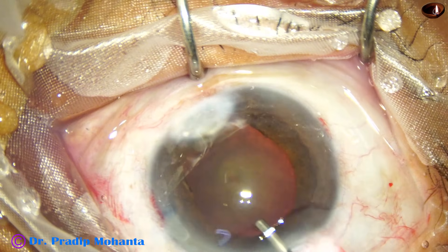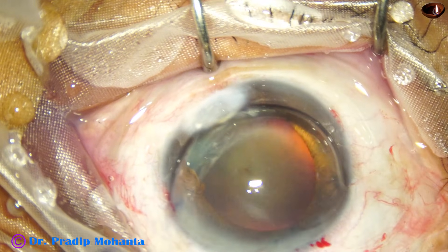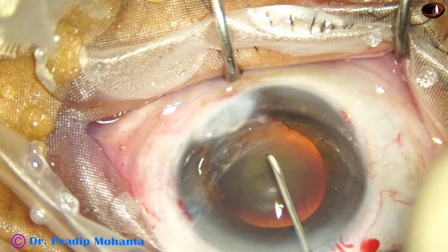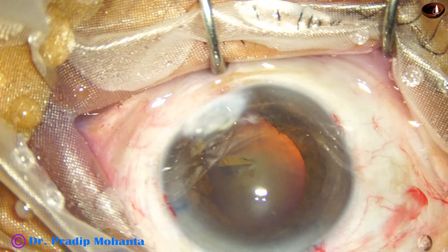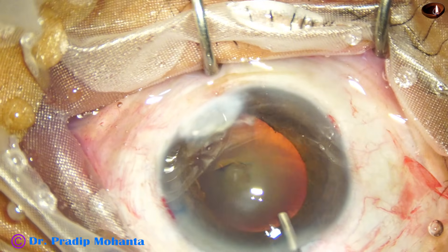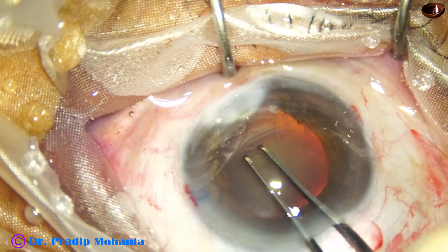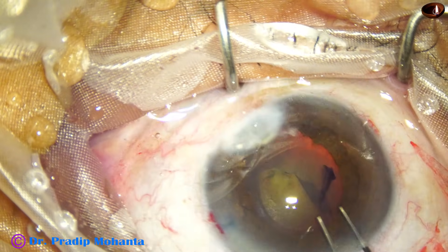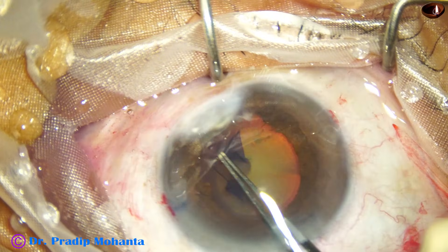There is some zonular weakness. I could not pierce the capsule with the utrata forceps. So I take the cystitome — a bent needle — and now this is the capsulorhexis.